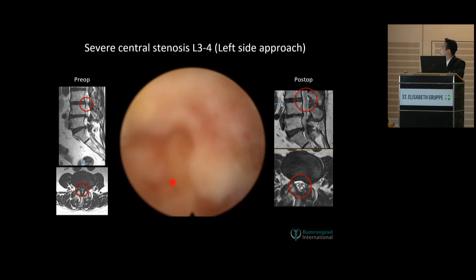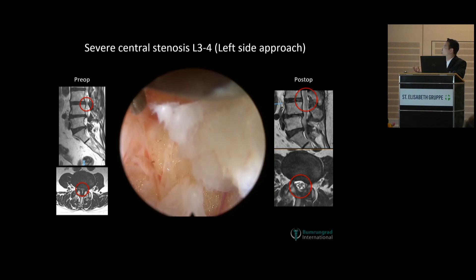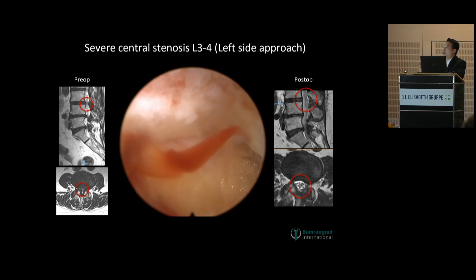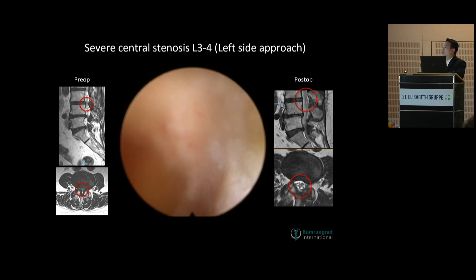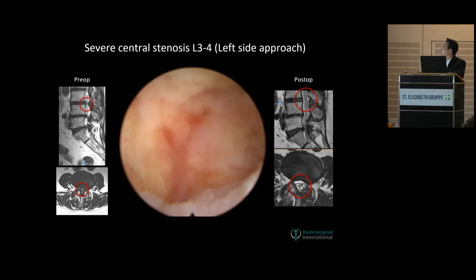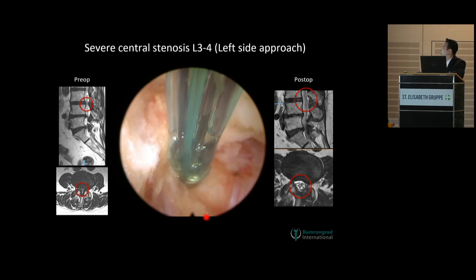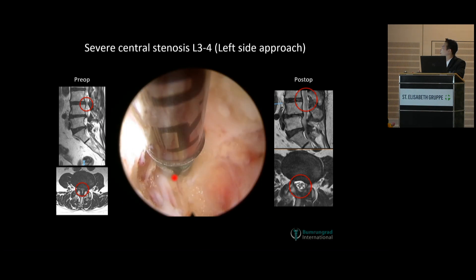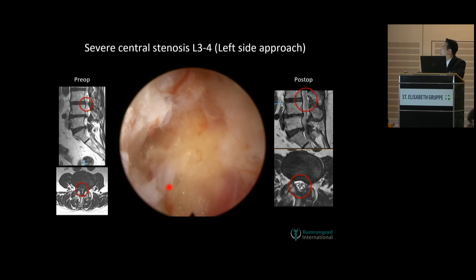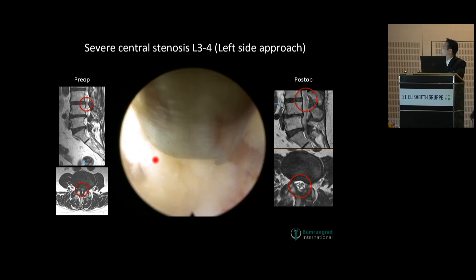Now you see the fat at the lateral recess of the ipsilateral side. The key is to turn the scope because the working channel is always eccentric. When you rotate the scope, your viewing angle will open up and your instrument will go more laterally, more peripherally to the working side. Now you see the ipsilateral space of the lateral recess. This is the clear edge of the nerve. We can use a coagulator to stop the bleeding from the epidural vein and cut the flavum.